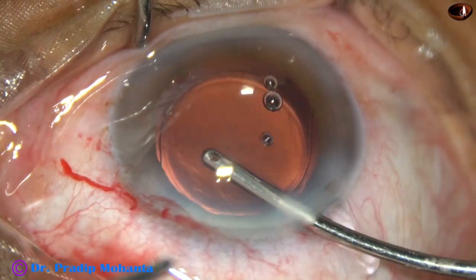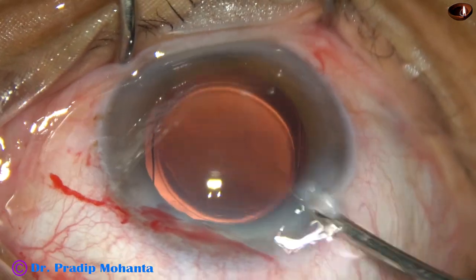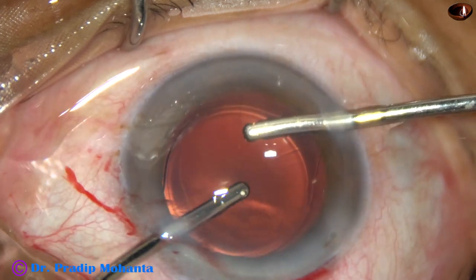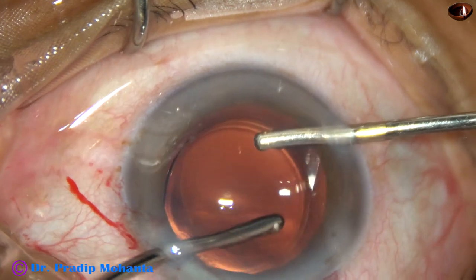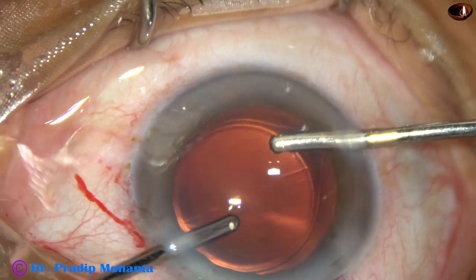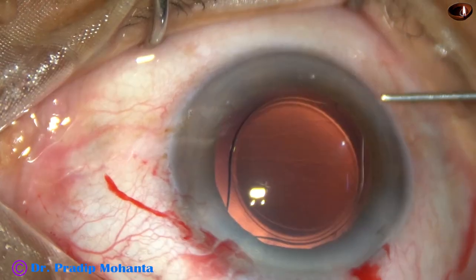First, the irrigation — the anterior chamber is irrigated and viscoelastic from the anterior chamber is nicely removed. Irrigation and aspiration is used together and all the viscoelastic is removed. If there is retained viscoelastic behind the lens in the capsular bag, it can give rise to viscoelastic-induced raised intraocular pressure, and the patient may be very uncomfortable in the night.